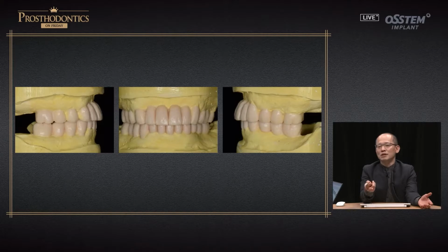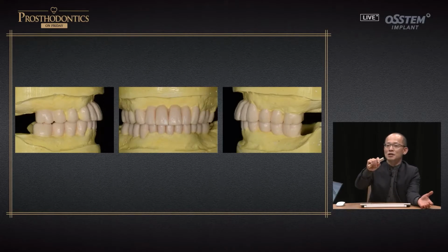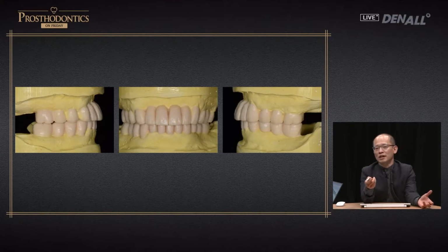So this is a very textbook procedure. VD and occlusal plane are assessed. In case of VD, on the occlusal side, rather than looking at the space aesthetically, you check whether there is a sufficient profile, and in the diagnostics, VD and occlusal plane are assessed. In the final restoration, you have to recheck again.